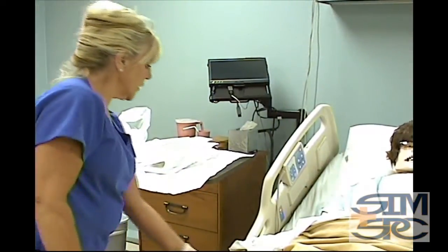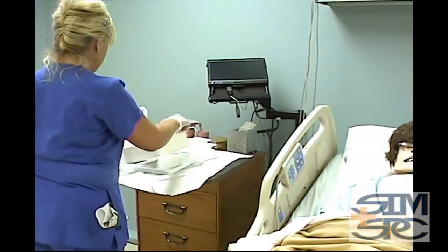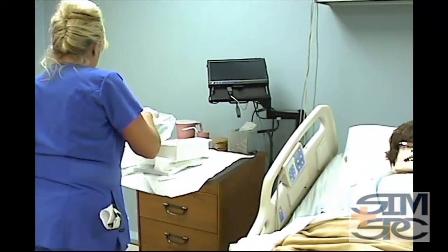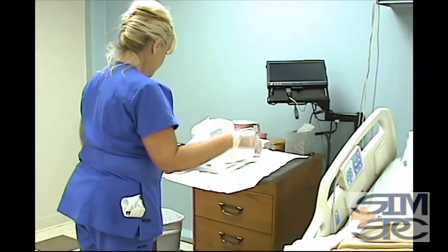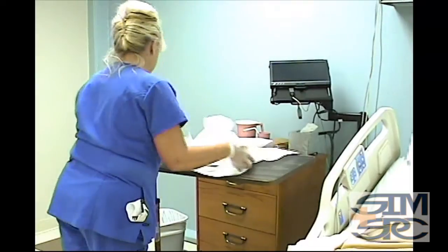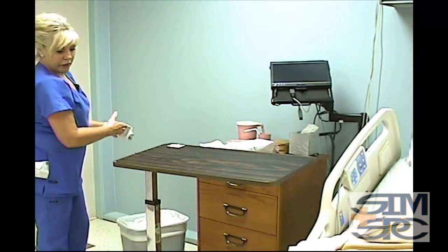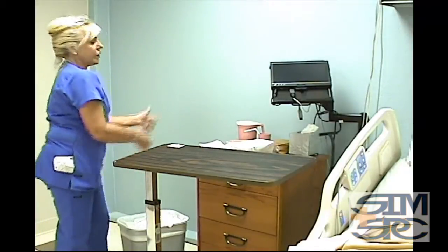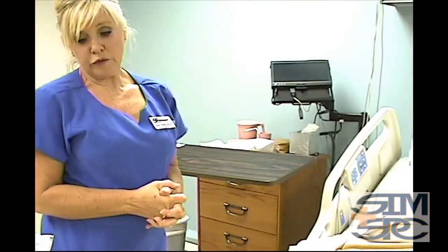One thing we want to make sure and ask the patient if she has any needs at the time, if she's okay, how she tolerated it. And we're also now going to get our mess cleaned up. And we're able to dispose of this. Once we're through with that, go ahead and wash our hands. And make sure the patient is still in the safe position. Recheck, make sure safety locks and everything for our second check.